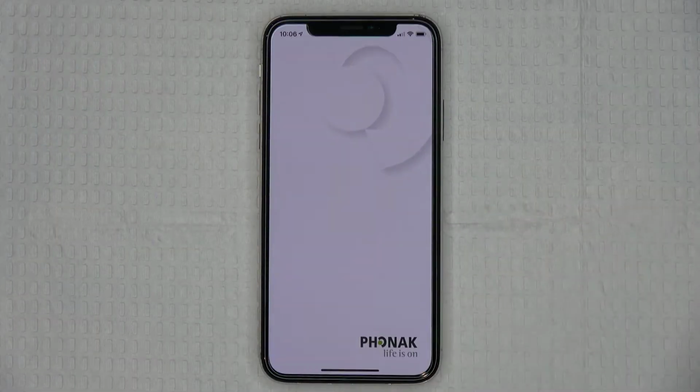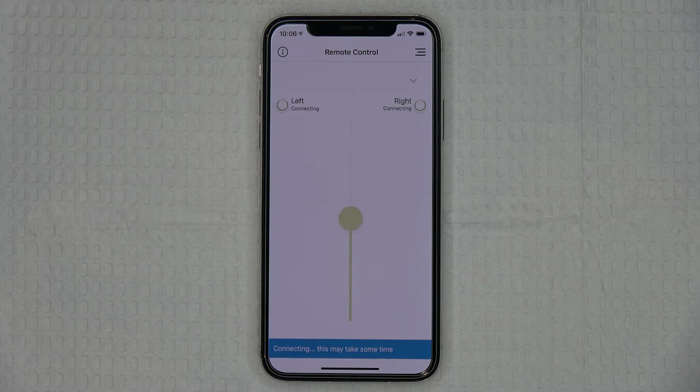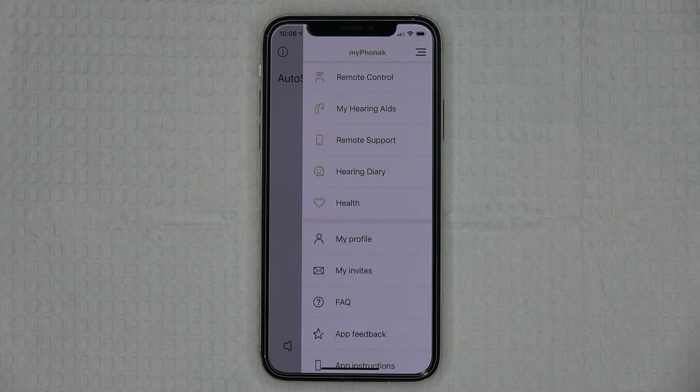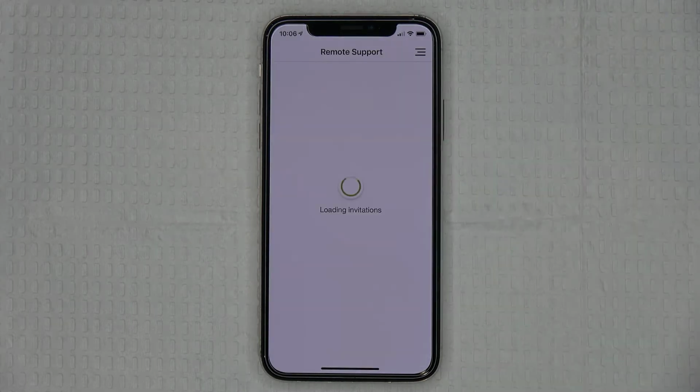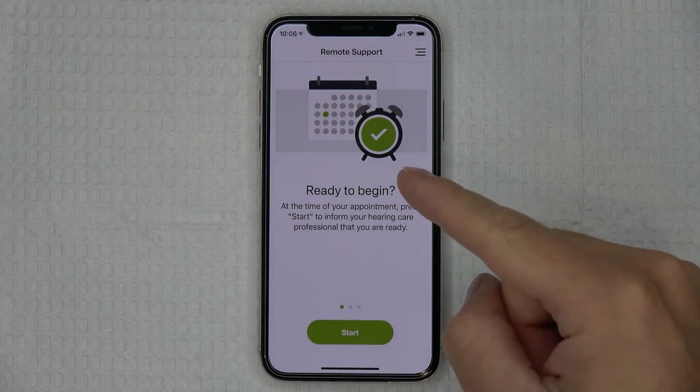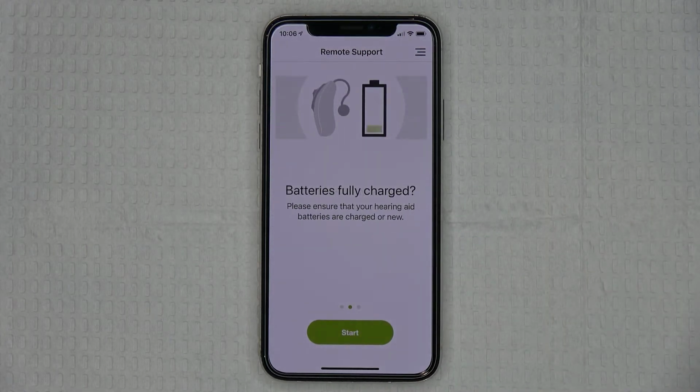To initiate a remote programming session, open up the My Phonak app, tap on the menu icon in the top right-hand corner of the remote control screen, then tap on Remote Support. You should then see a green Start button at the bottom of the screen. And you'll also see some general instructions in regard to ensuring you have a good internet connection and suggesting that you replace your batteries or fully charge your hearing aids before you start your session.